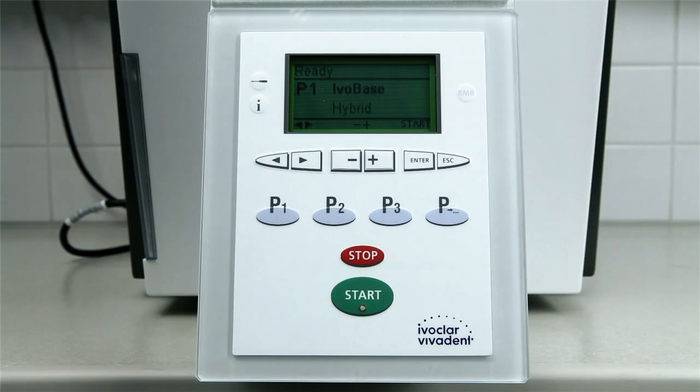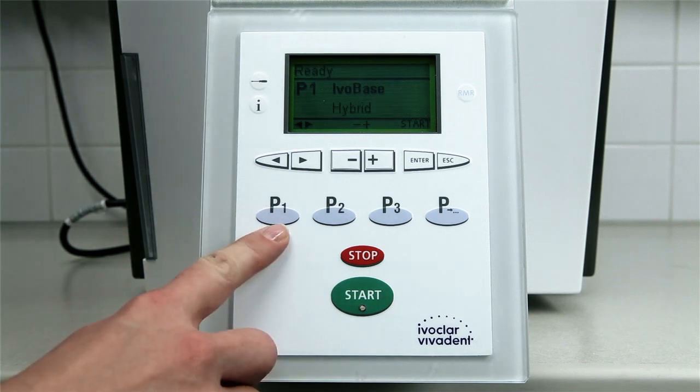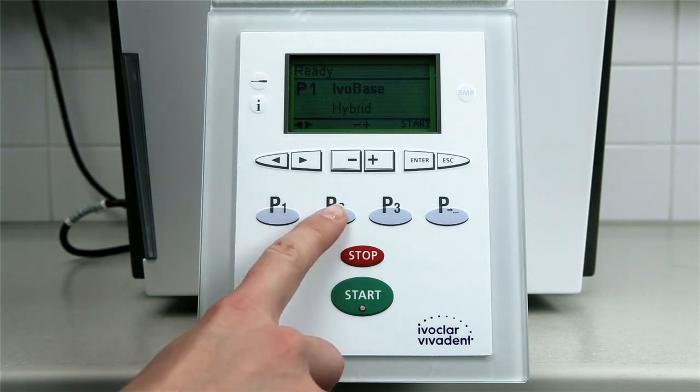For optimum results with IvoBase Hybrid and IvoBase High Impact, the IvoBase injector is equipped with polymerization programs especially designed for the respective materials: P1 for Hybrid, P2 for High Impact.